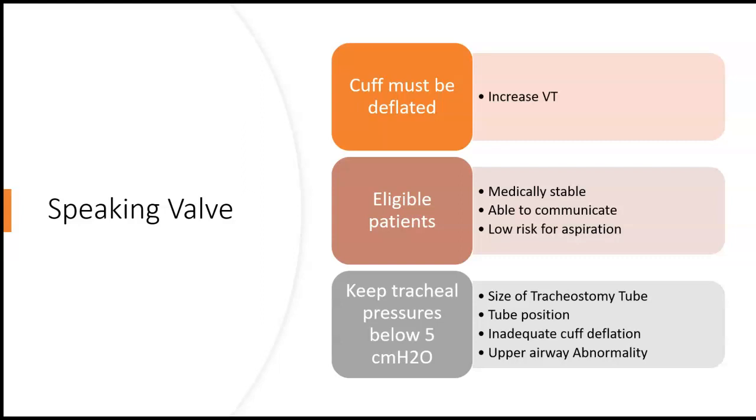If it's not deflated, then the patient's not going to have any ability to exhale because of that one-way valve. So you need to make sure that the cuff stays deflated. Because that will cause a leak, if the patient's on the ventilator, you may need to increase their tidal volumes a little bit.